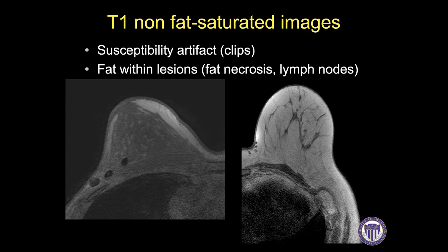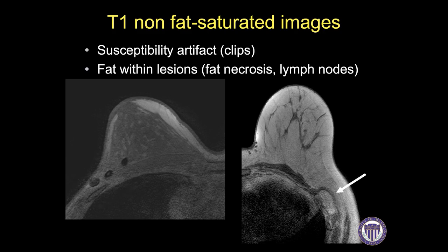On the T1 non-fat saturated images, I look for susceptibility artifacts such as surgical clips or biopsy microclips. In this patient who has had a prior lumpectomy, I can identify the lumpectomy site from the susceptibility artifact from her surgical clips. I also evaluate for fat inside lesions such as fat necrosis, lymph nodes, and in this case, an incidental intramuscular lipoma.